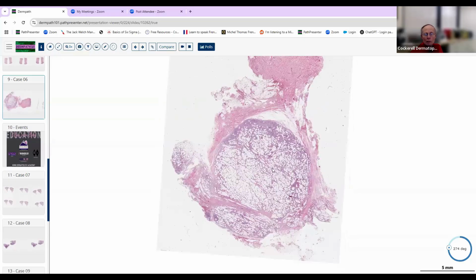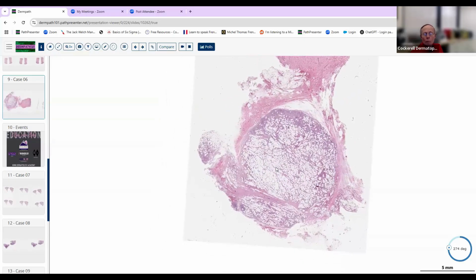So once again, we apply our criteria. When things are deep, sometimes we get a little bit concerned about them as possibly being malignant. Like a metastasis, for example, might be a deep lesion, a deep subcutaneous tumor, something like that. But not always. You certainly get subcutaneous lesions that are benign, and so you still apply your other criteria.